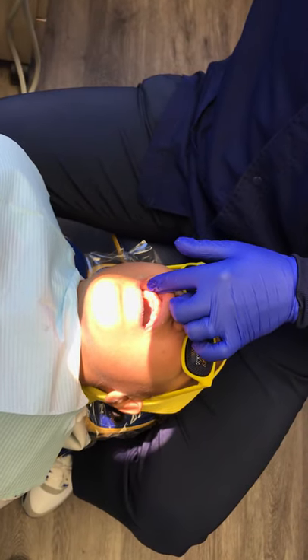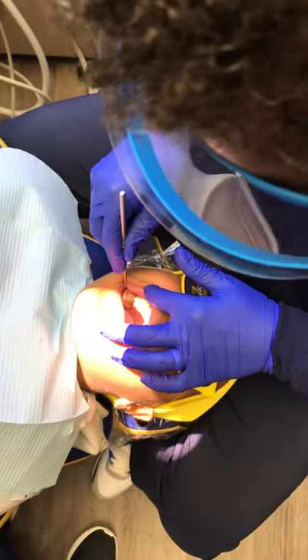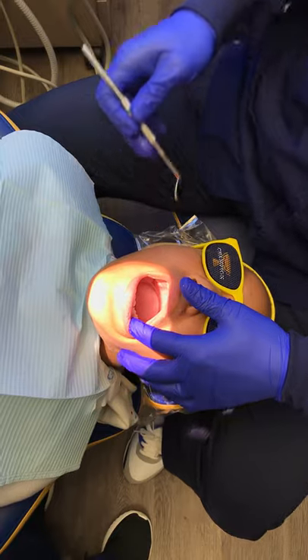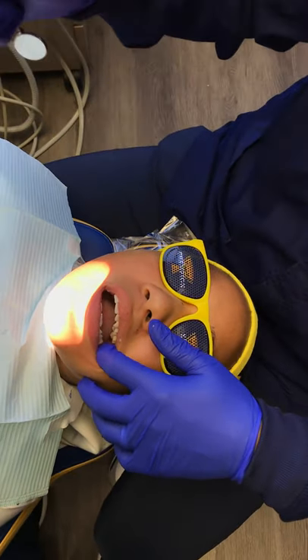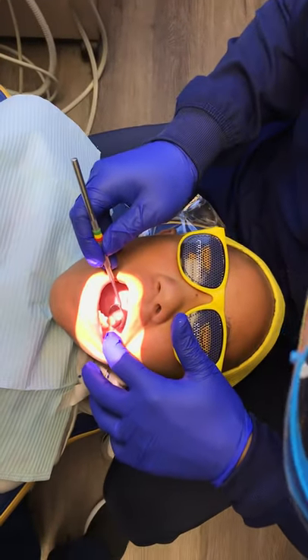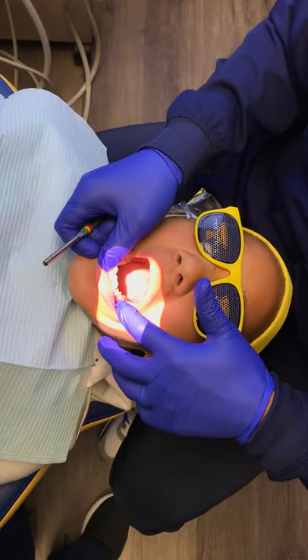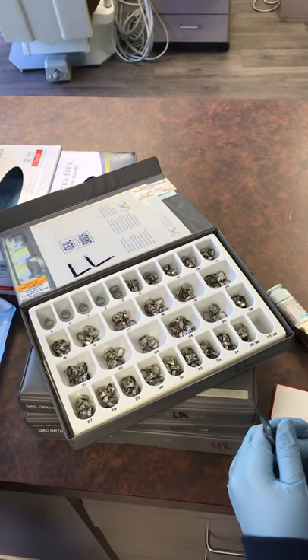Now, once the separators are out, we can start fitting the bands. We're going to start with the lower bands. The first thing you do — I'm going to adjust your chair. Dress that light for me. Tip your head down towards your chin. Open really wide. First thing you do is you just take a look at the tooth and get an idea of how big the tooth is. Then you go over to your box of bands.